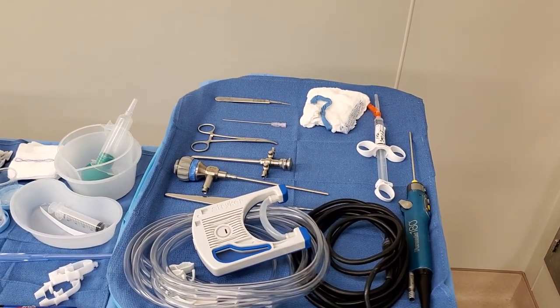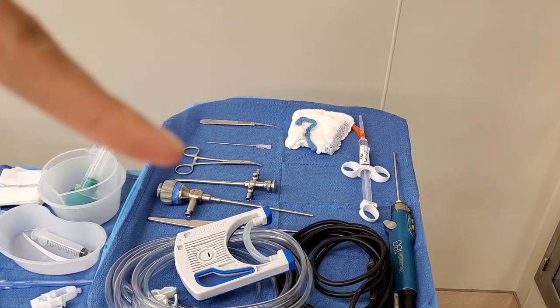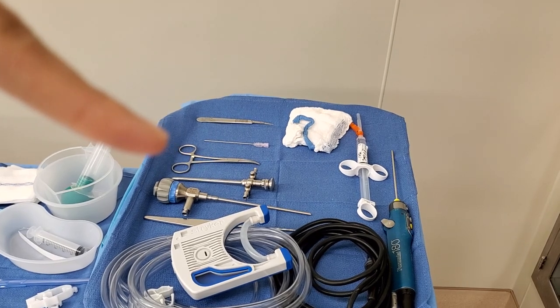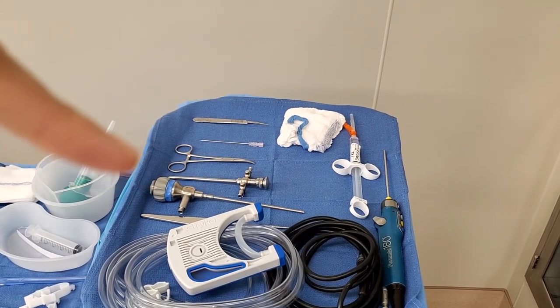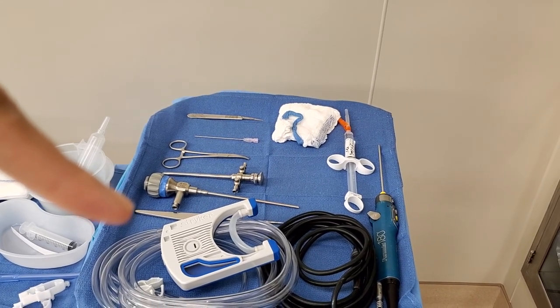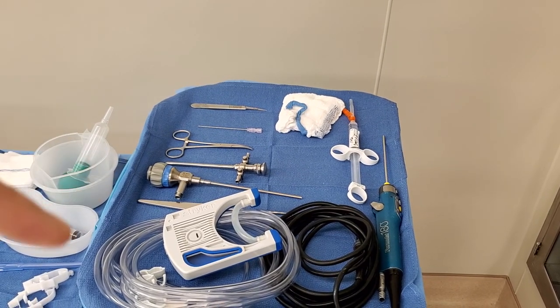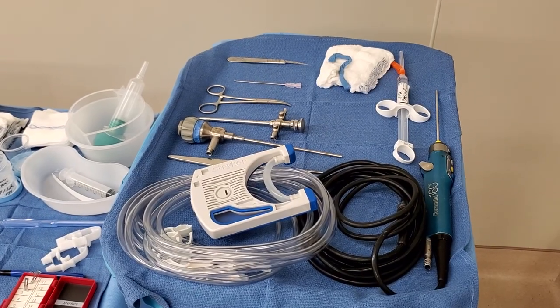That is the 11 blade, a spinal needle, hemostat, one of the trocar obturators, camera scope. There's also — I forgot what it's called, let me ask Chelsea. It's a wolf probe.